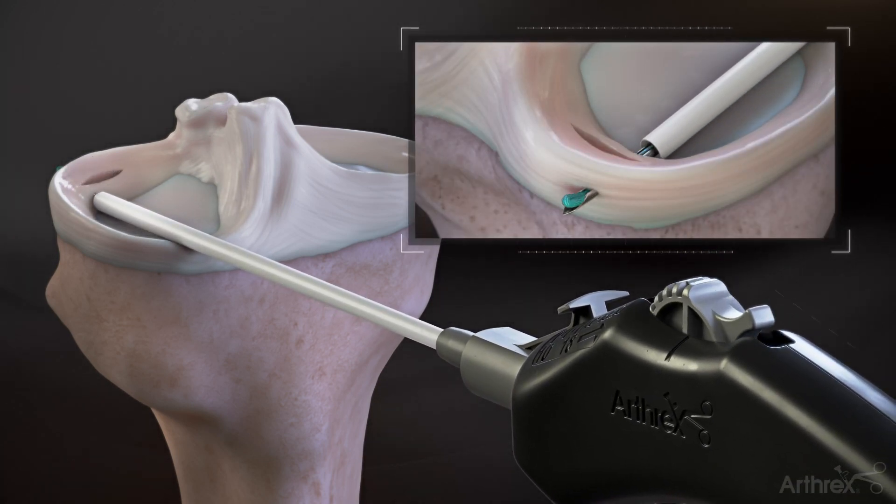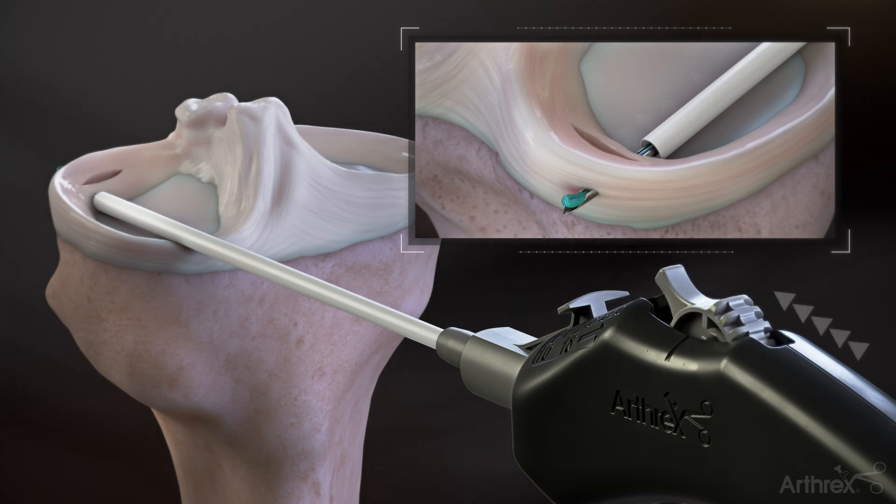Roll the deployment wheel backwards to the hard stop to deliver the first implant. Roll the deployment wheel forward to the hard stop to load the second implant.